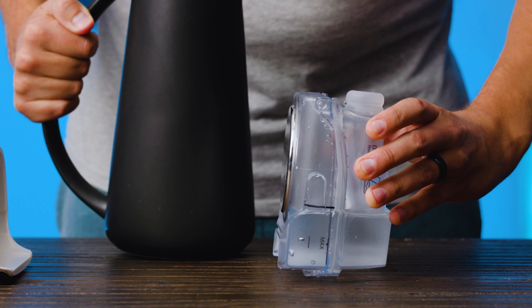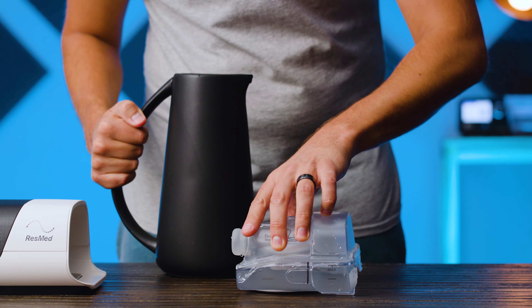Once the line is submerged, turn the chamber so that the opening faces the ceiling. The water level should reach the marked line you have drawn. If not, tilt it back to 45 degrees and fill a little bit more. Once it is at that level, you can place it on the table and the water should be exactly at the maximum fill line on the chamber.